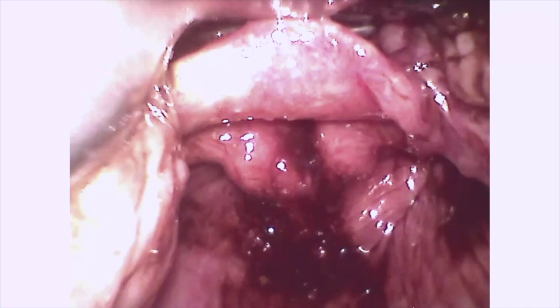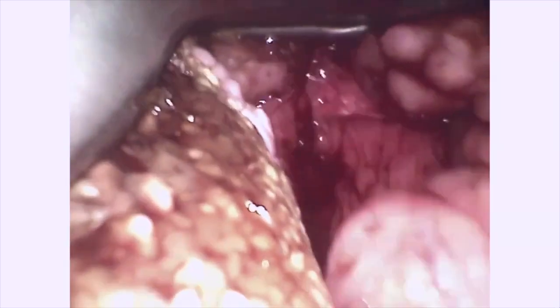Absolutely. We're seeing that the tonsils, as we had approached, are edematous. So maybe there's something going on there. There's clearly a lot of blood. And is it from a tumor? Is it from trauma? We don't know, of course, in this situation. Let's go ahead and play and see what happens next.